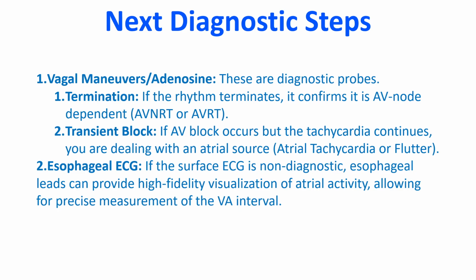If the surface ECG is non-diagnostic, esophageal leads can provide high fidelity visualization of atrial activity because the left atrium is very near the esophagus, allowing for precise measurement of the VA interval.